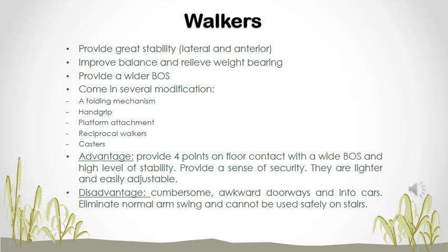There are lighter and easily adjustable types, but normally they are a bit more cumbersome and heavier than standard crutches, for instance. The disadvantage is that it is cumbersome. It's awkward to get through doorways with it and in cars. It eliminates the normal arm swing and cannot be used safely on stairs.